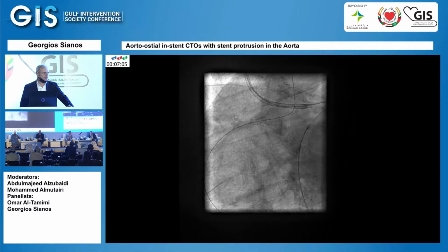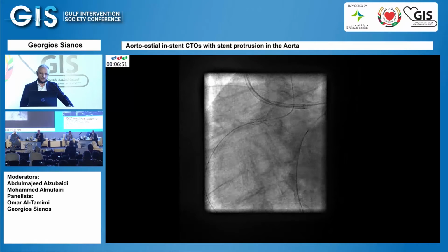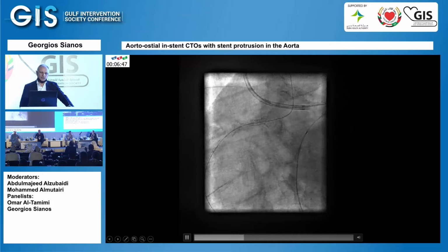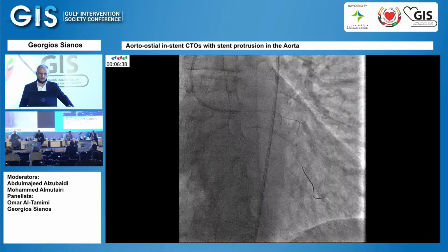That's a very interesting point, because the main thing that you have to do, as you will see here, even if the wire was going through the entire length of the stent, this should have been avoided. I'm going to touch a little bit on the floating wire again. So this is the right thing to do. The wire should go through the strut to the aorta that is really protruding, and you have to exclude the rest of the protruding stent with intervention, as you will see what happened here.